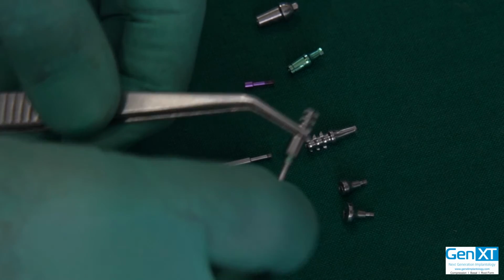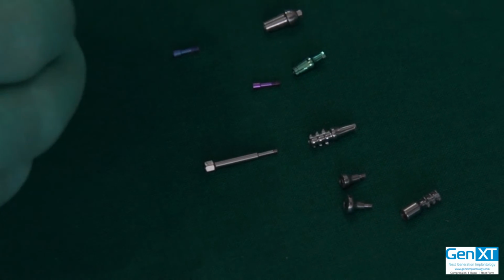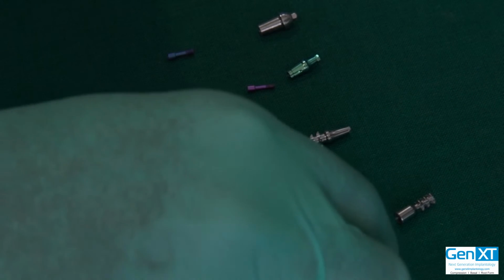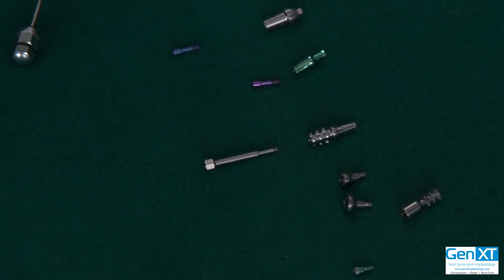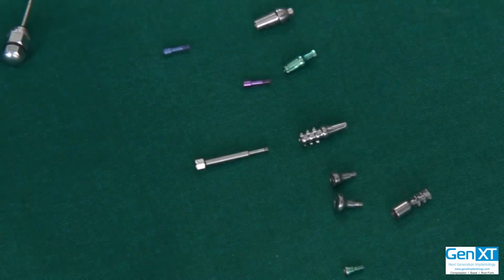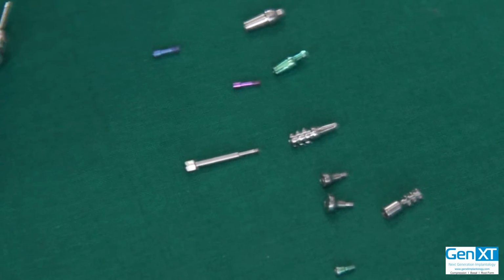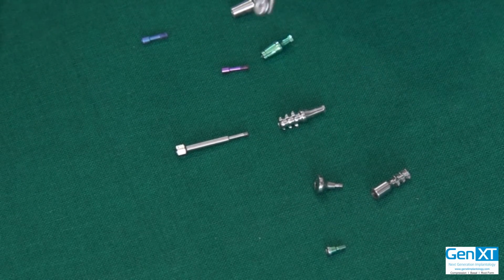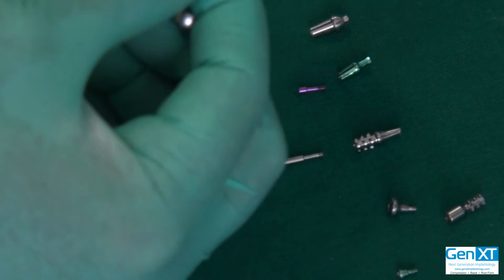One very unique thing about the system which I really appreciate is the gingiva formers. Now most of your gingiva formers are one piece gingiva formers, right? That means they rotate into place. This means that they have to be circular, correct? In this system, the gingiva formers are two-piece. So there is a gingiva former and then there is the screw inside it, just like your abutment or anything else.